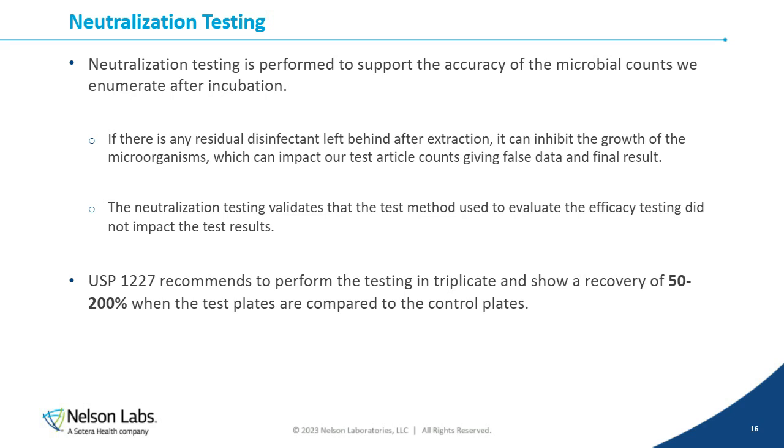And what that means is, after the disinfection process, you need to extract your devices using a neutralizer, a solution that has properties that are known to neutralize the active ingredients in whatever disinfectant you are using, so that we can accurately recover any viable organisms that may be left on the samples after that disinfection procedure.